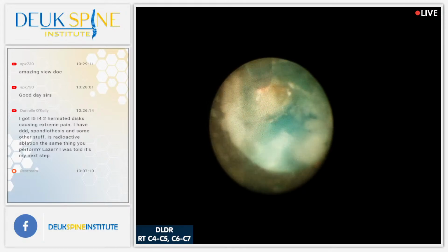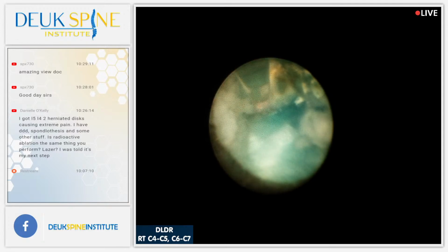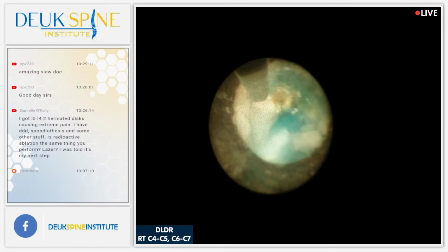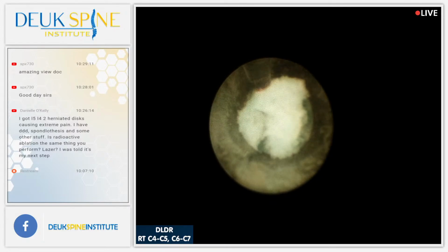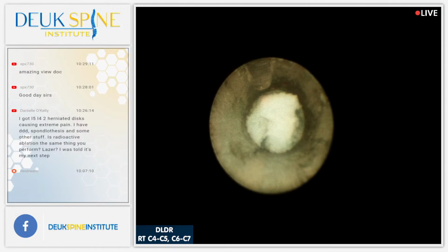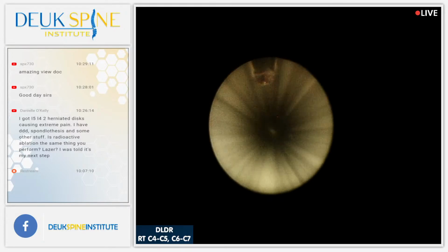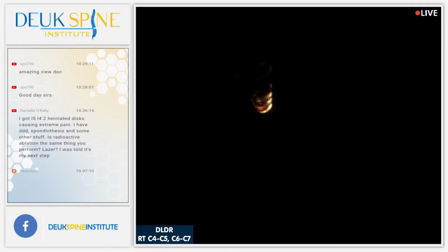So this is truly what's called a decompressive discectomy. In the medical CPT code world, this is a 63075, a decompressive discectomy. Here it comes. Boom! Wow, was that awesome or what? Did you get that on video? Yes, we did. Save that segment. That's beautiful. There's a huge herniation. All right, so how many pieces have we counted? I've got at least 7 or 8 now.